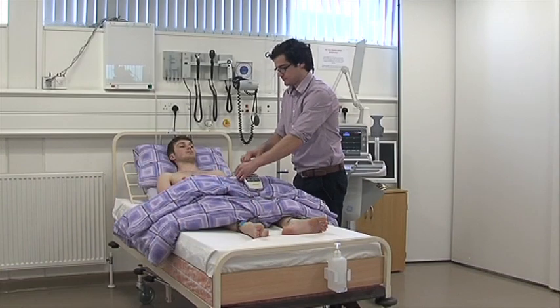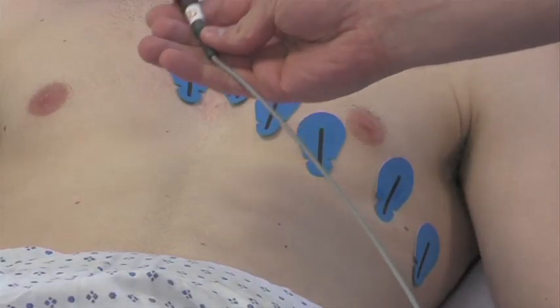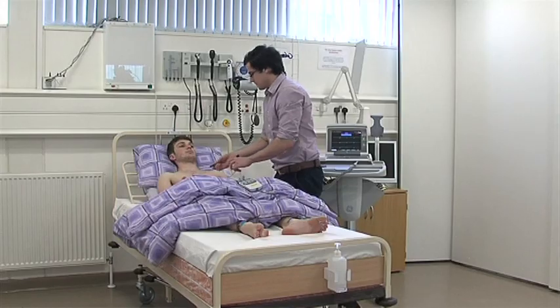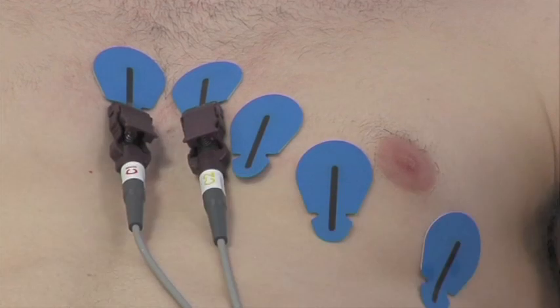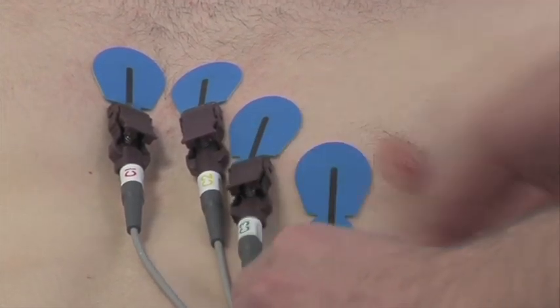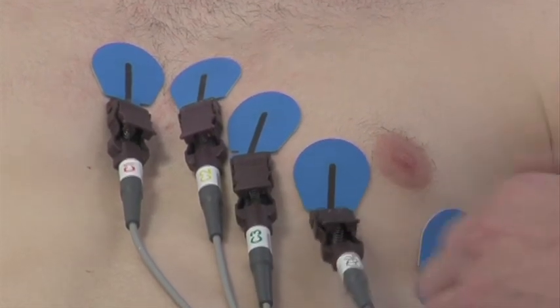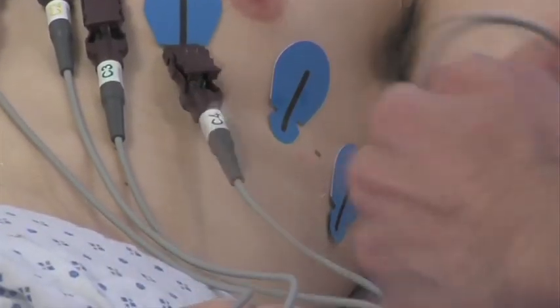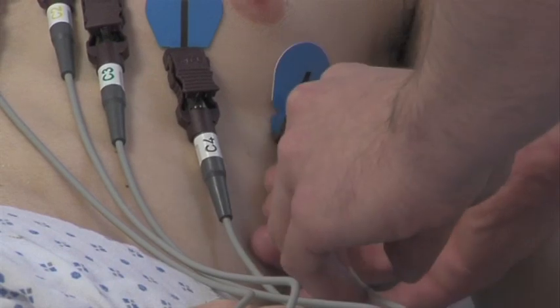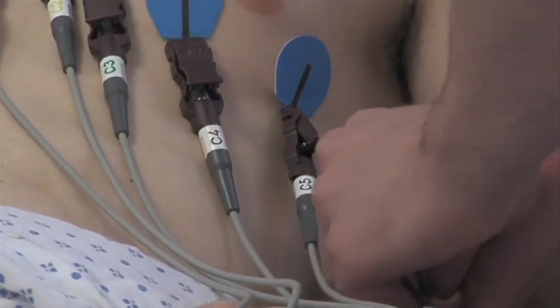Chest leads should be attached to the corresponding electrodes. C1 to V1, C2 to V2, C3 to V3, C4 to V4, C5 to V5, and C6 to V6.